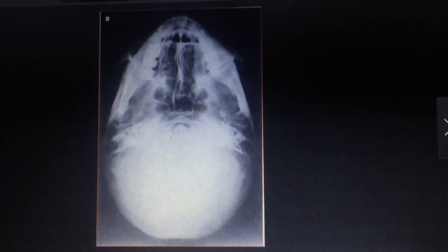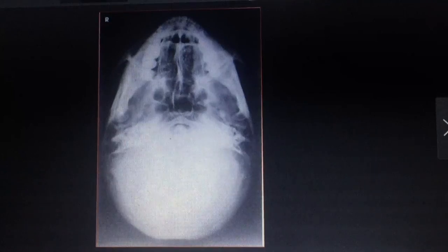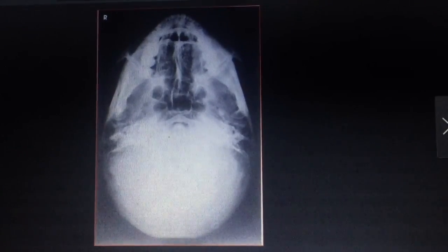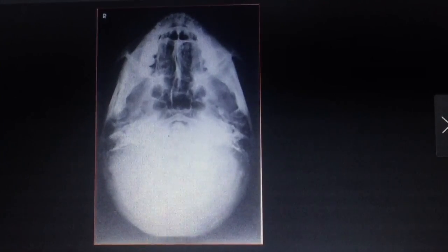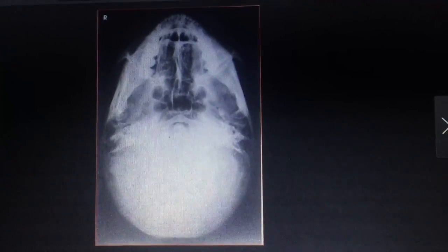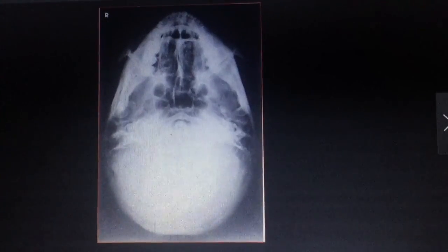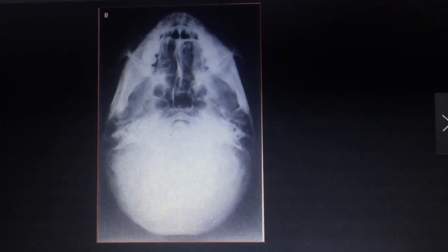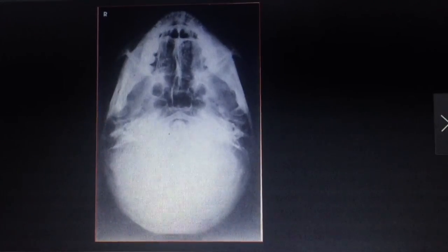That there is superimposition of the mental protuberance over the anterior frontal bone, which indicates the full extension of the neck. Also, that the mandibular condyles are anterior to the petrous pyramids and that there are symmetric petrosa. All is present in this image, so now it is deemed acceptable, and this will conclude the evaluation of my skull images.